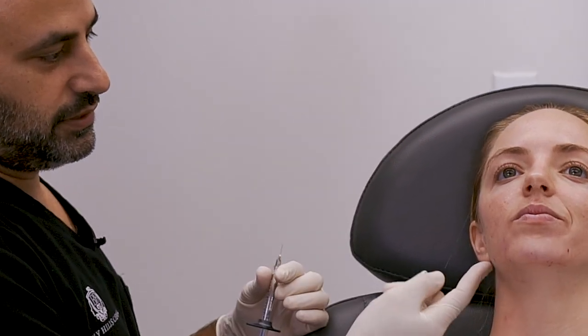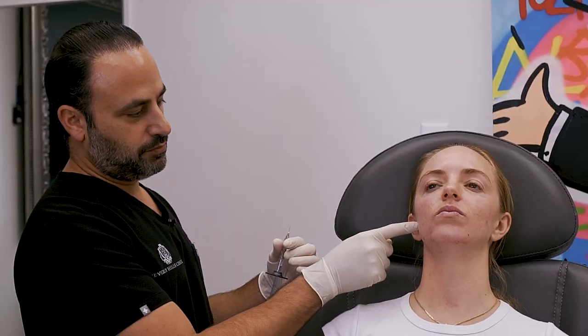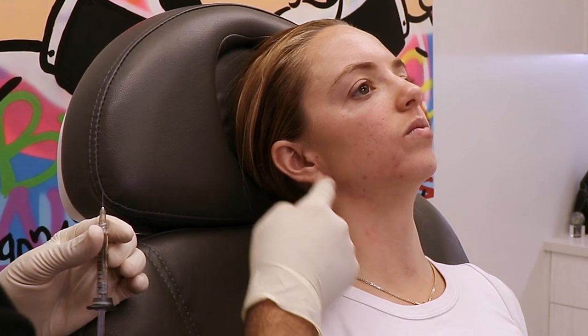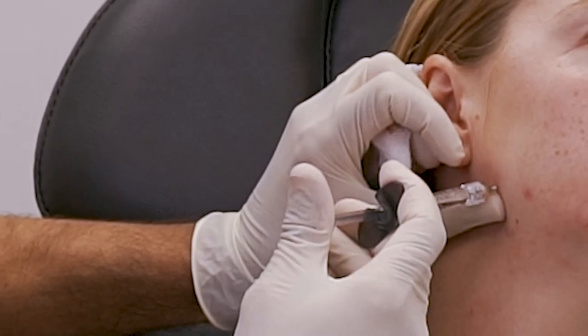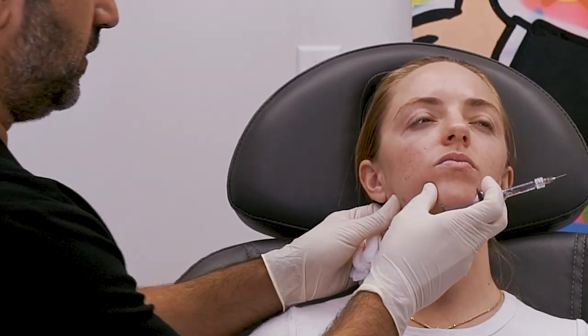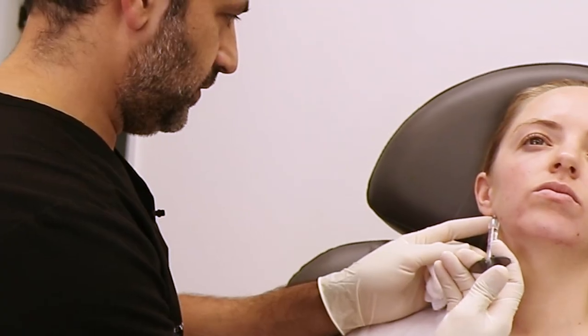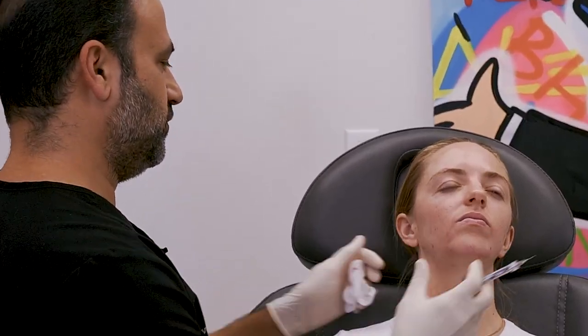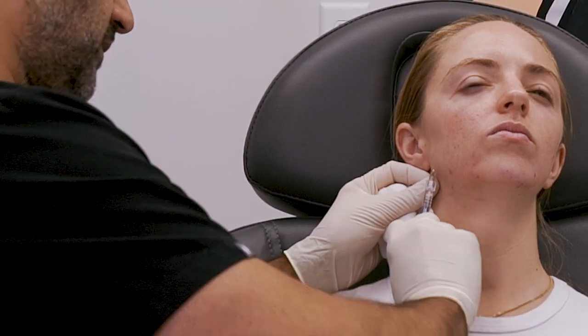Looking at the jawline, there are two ways to do it. One is to go down onto the bone and pop it outwards — that gives lateral projection. The other is to build a new appearance of a mandible by going subdermally. Too much of that makes you look like you have a parotid gland tumor. On Allison we're just going to do a little tiny bit — go down onto the bone, aspirate, march it in a couple spots, then draw it superficially right under the dermis. We're going to go upwards to draw out the ramus of the mandible.